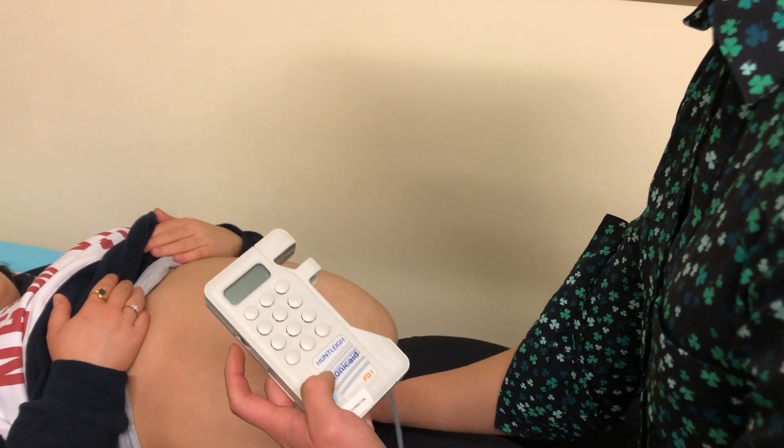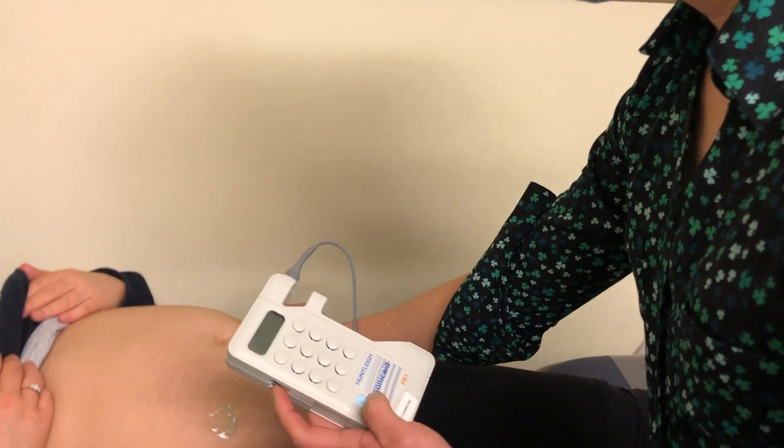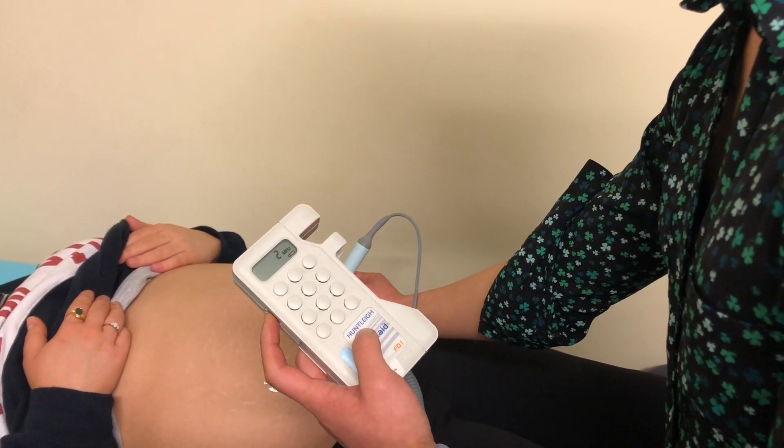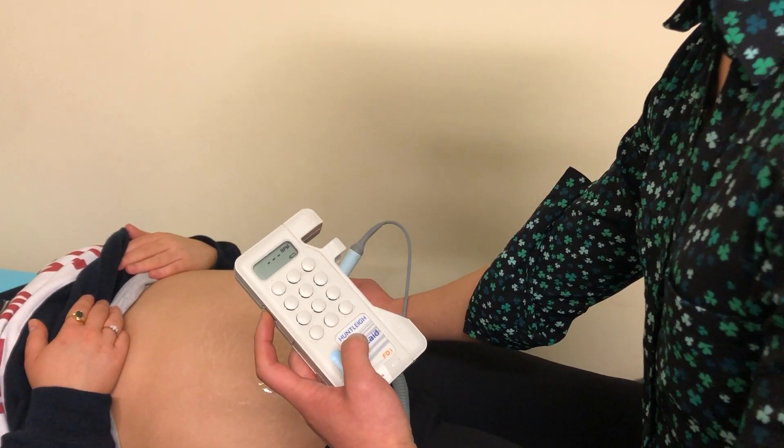Out of interest, we'll just have a listen on the other side. That's a bit more of a click-clacky sound, which suggests that that's more likely closer to the fetal heart.